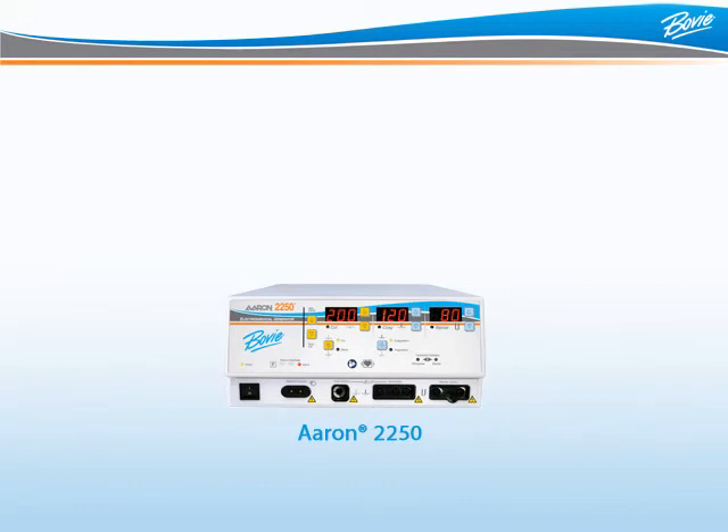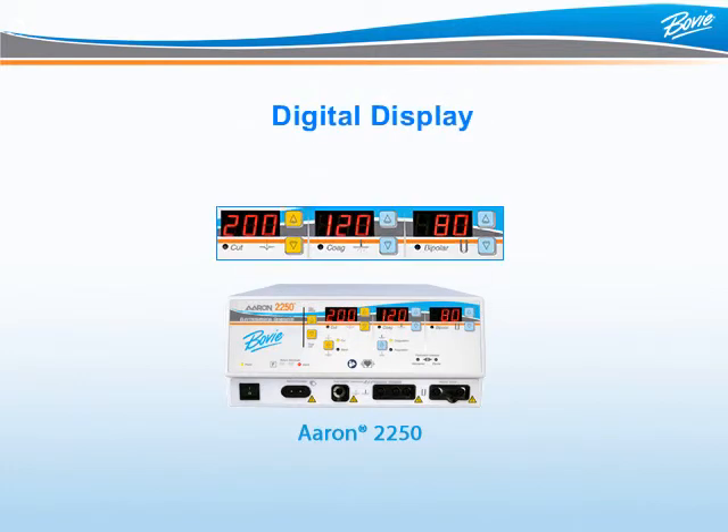When powered on, the Aaron 2250 automatically powers up to the last used settings and performs a safety system check. Like all Aaron generators, the Aaron 2250 illuminated digital display is expressed in watts. To adjust the power output, simply press the up-down buttons to the right of the number.